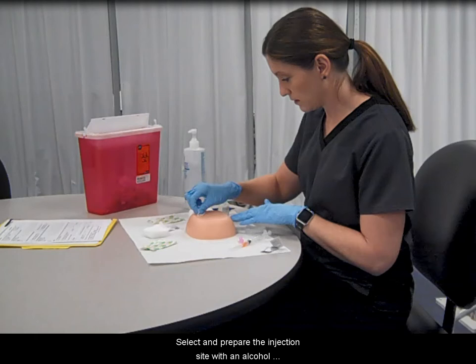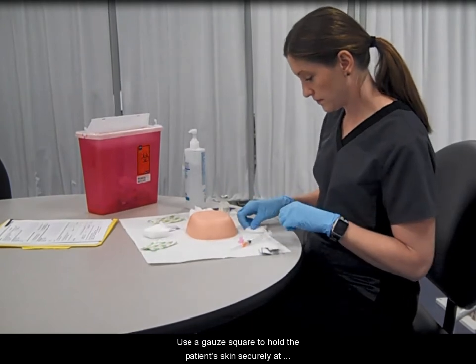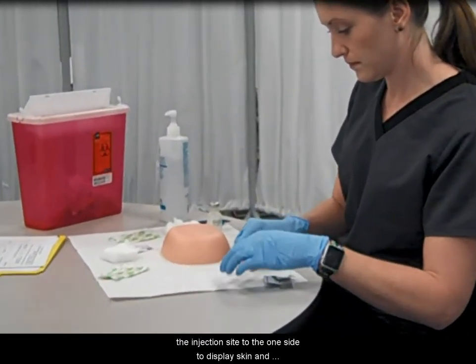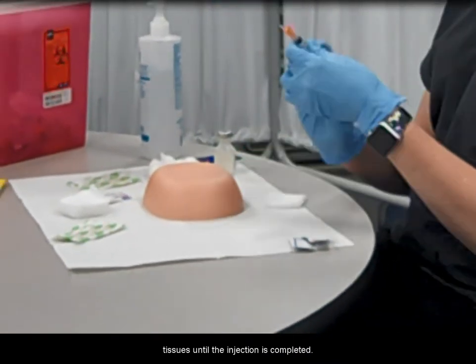Select and prepare the injection site with an alcohol prep pad. Allow the alcohol to air dry. Use a gauze square to hold the patient's skin securely at the injection site, pulling to one side to displace the skin and tissues until the injection is completed.